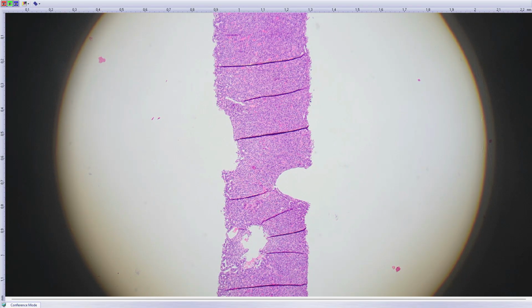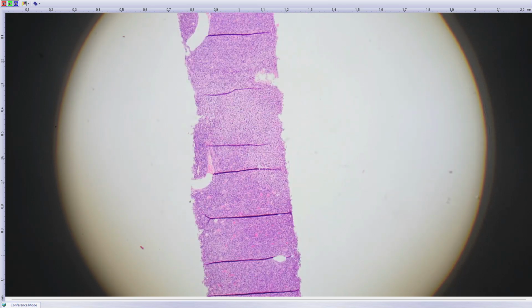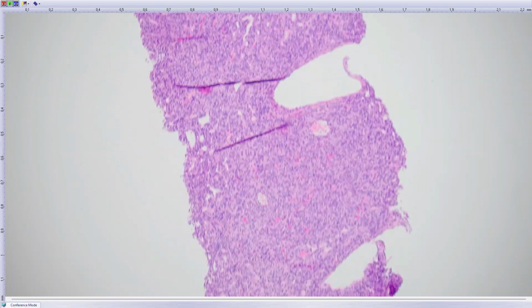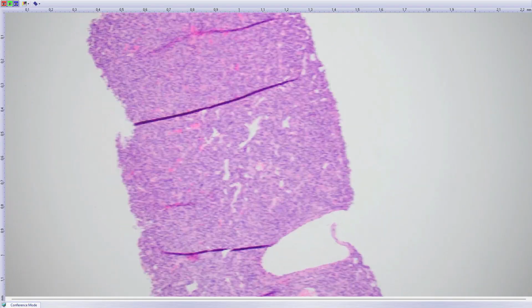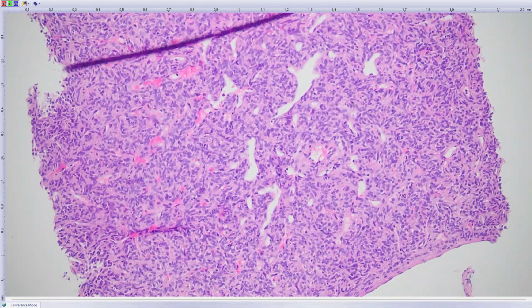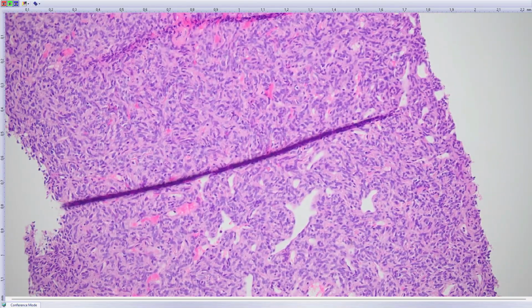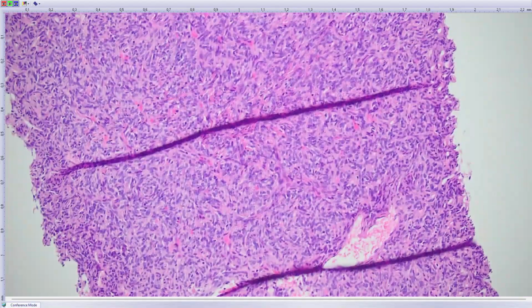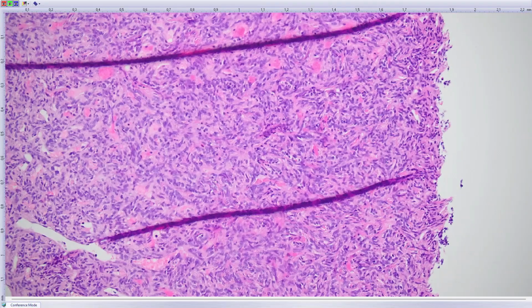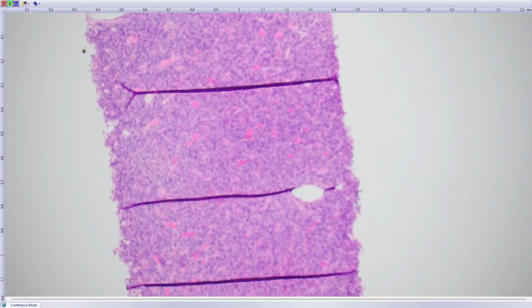This was a 75-year-old female, tumor in the abdominal cavity, and there's just this one punch biopsy. Luckily for us and for the patient, it's a very good punch biopsy where everything we need is actually captured. Anybody besides Marion knows what this could be? Any suggestions? Don't be shy. It's really that. It's STAT6 tumor. Yes.